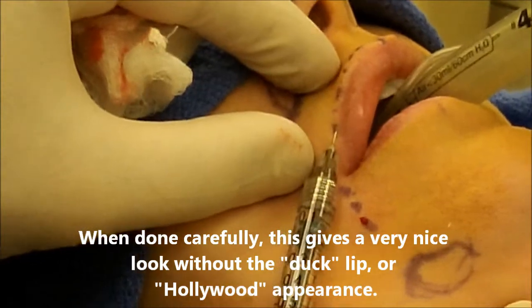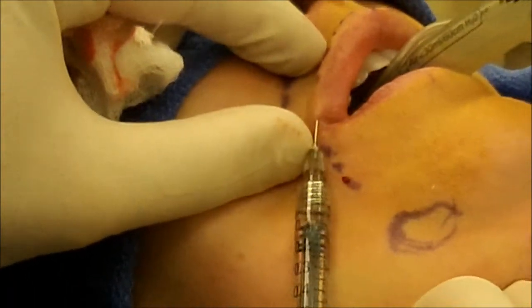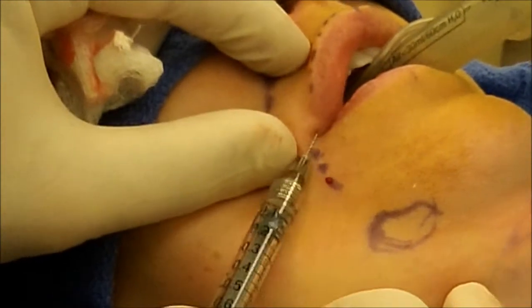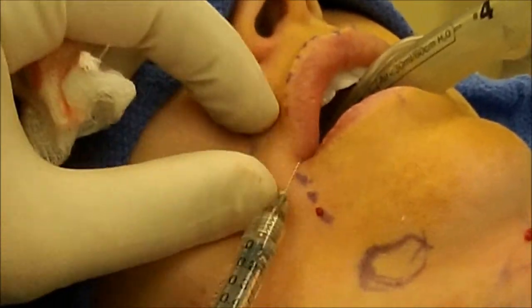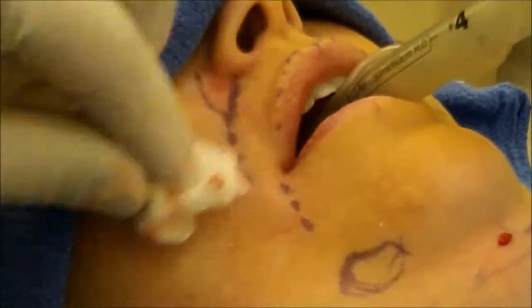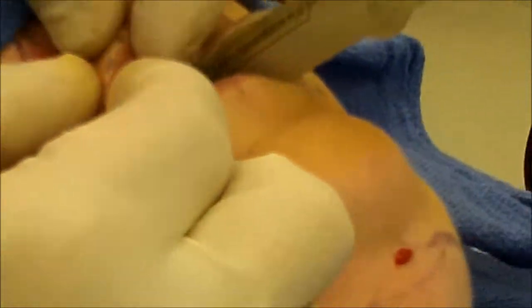Just to line the lips and give a little fullness to the upper portion of the lips. It helps the lipstick stay in place and defines the corners of the lips a lot better. It doesn't make your lips big or pouty — it just gives a little bit of fullness. You can see that little bit of rim and very small injection amounts to give that fullness. Now you can see we've done the top of the lip and given it a little bit of fullness.